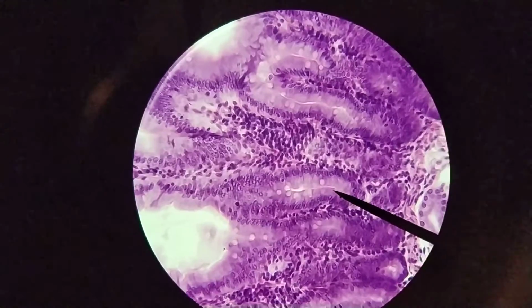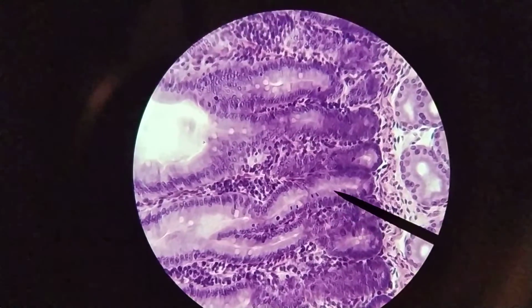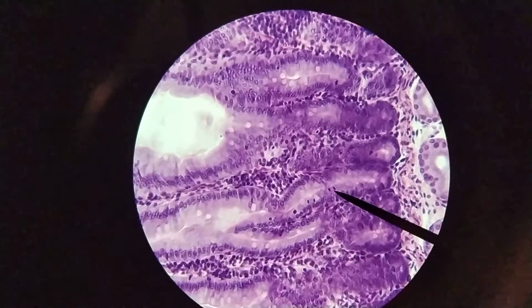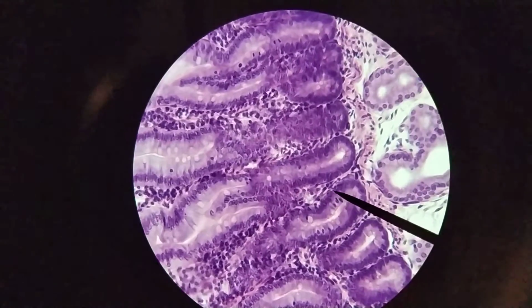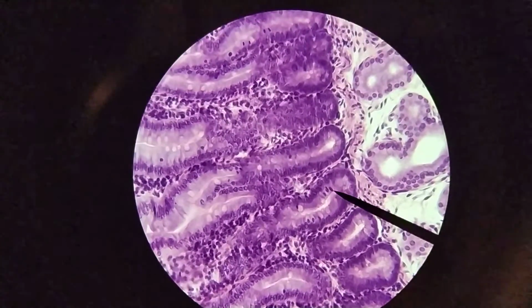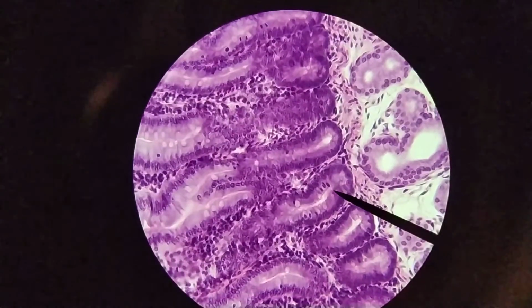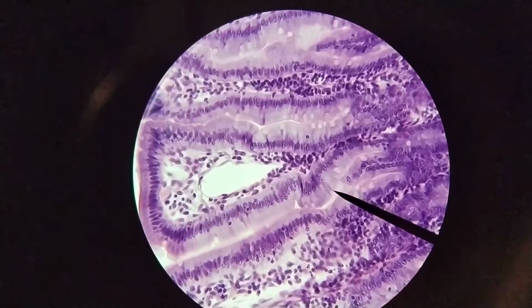And so again, if you look at this epithelium here, there is, for example, here, pretty obvious case of probably telophase by the looks of it, maybe late anaphase. Okay, so we're seeing signs of cell division going on in many of these crypts of Lieberkühn. Again, you can see that pretty clearly here as well. Okay, and so these Brunner's glands down here in the submucosa open up into the bases of these crypts of Lieberkühn, which is connected to the spaces in between the villi, and that is in contact with the lumen.